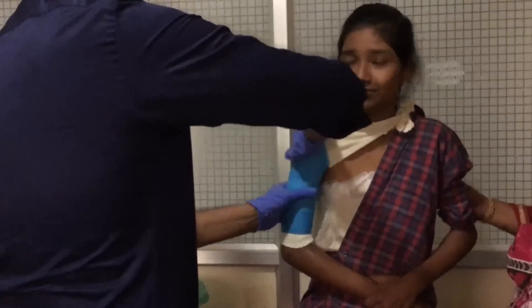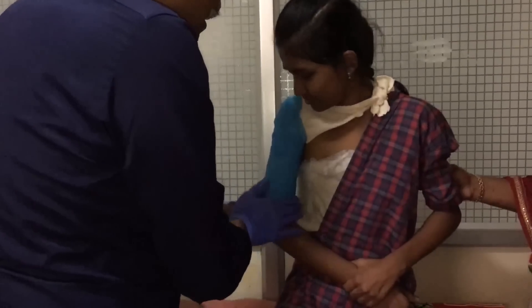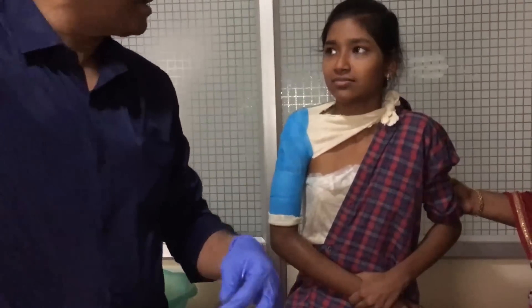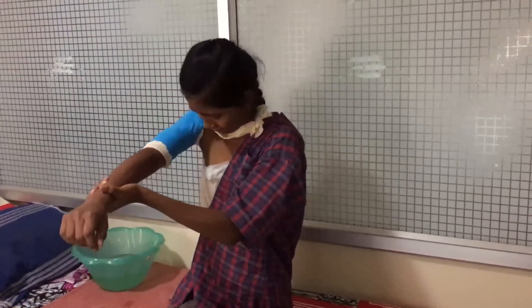One roll of bandage gives a brace of adequate thickness and ensures that early ergonomic and physiological movements can be begun as soon as possible. The plaster sets in about half an hour and the patient is able to move her arm with minimal discomfort immediately after bracing.